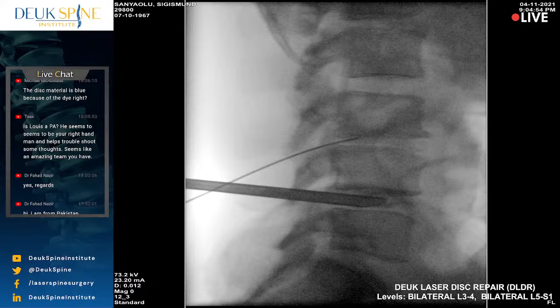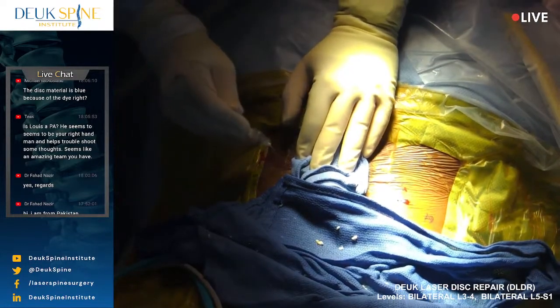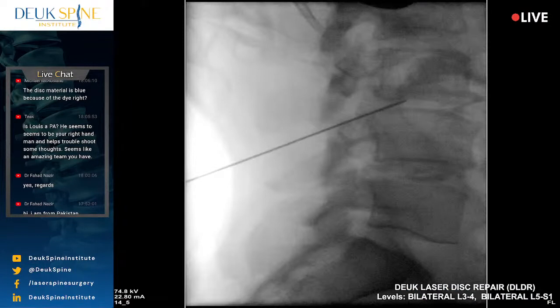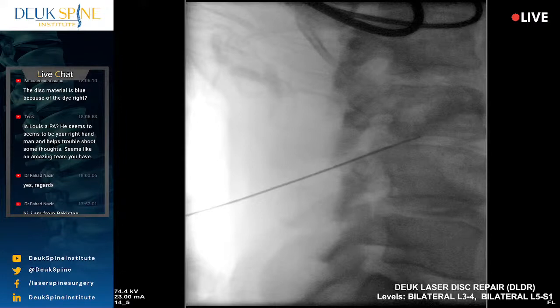Almost welded again. Go ahead, shot. Shot. Pressure here, Louise. You need to go a little more north with the fluoro. Shot. I was a little worried there for a second that I had welded that end too much. Shot.